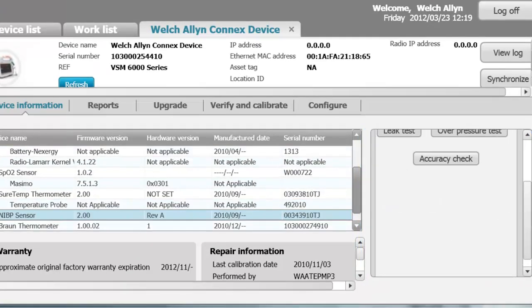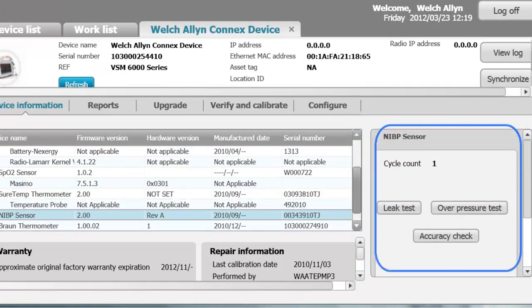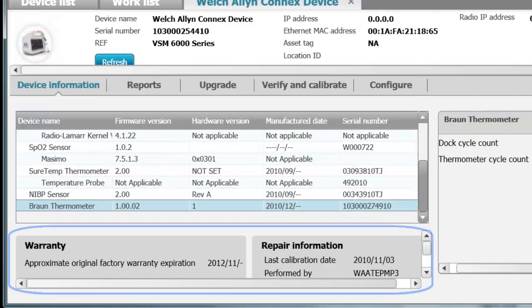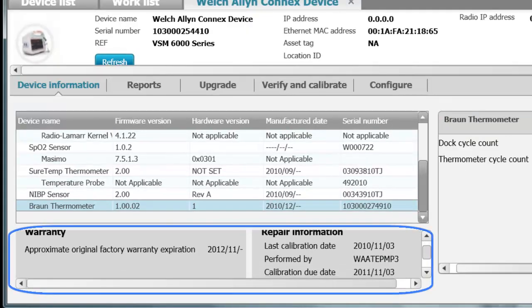Looking at the NIBP sensor, you can see the cycle count, and you can perform accuracy checks or calibration checks, a leak test, an overpressure test, and an accuracy check. On the Braun thermometer, you see the dock cycle count — the number of times the thermometer has been placed into the charging dock — and the temperature cycle count — the number of times the probe has taken temperatures. At the bottom, you can read the warranty information for the device. This device has a two-year warranty and was manufactured in 2010, so it will expire in 2012.